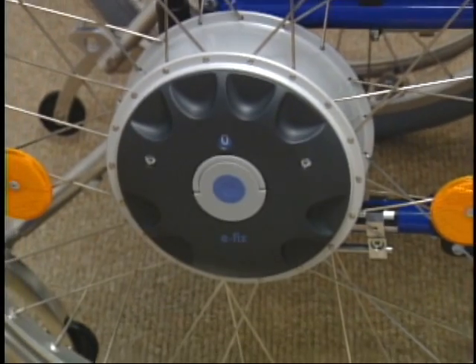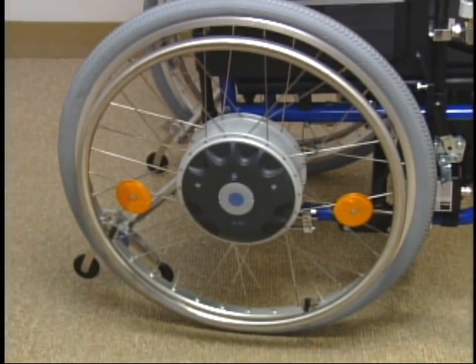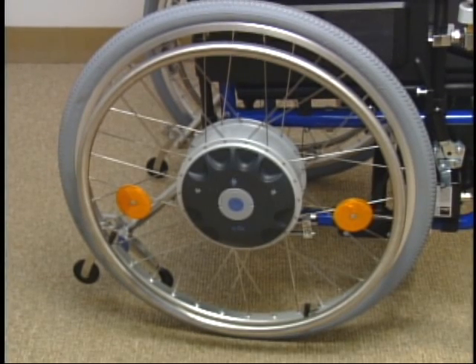Two drive wheels with maintenance-free motors, gears, brakes, and microprocessors are all connected and contained in the hub of the wheel.